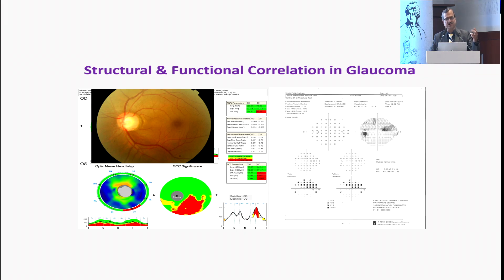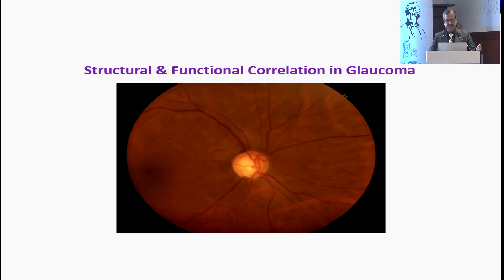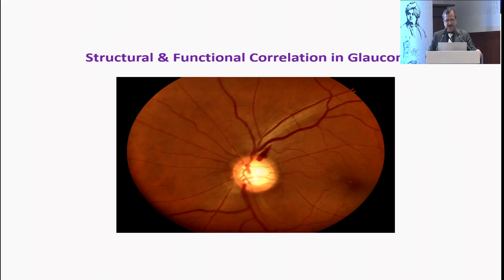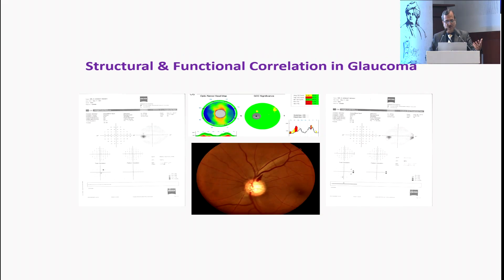If you see this disc, there is definitely an inferior excavation with dipping of the vessel. Correlating with the OCT, you also see a superior temporal defect as well as an inferior defect. That perfectly correlates with a superior arcuate defect and a focal defect in the inferior nasal step. Always look out for hemorrhage — this hemorrhage was present and the visual field was normal. You need to treat this patient, bring down pressures to the optimum level, because despite maintaining the pressure, you may slowly detect a focal glaucomatous defect in the inferior nasal step.